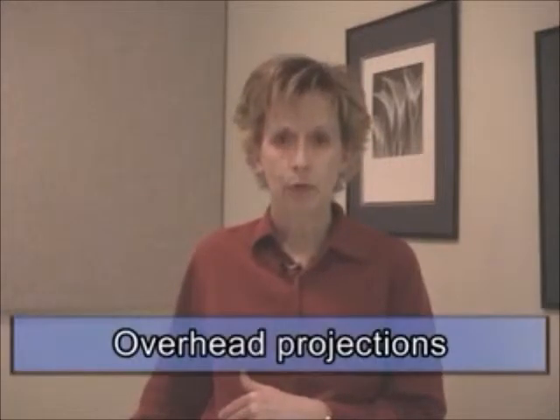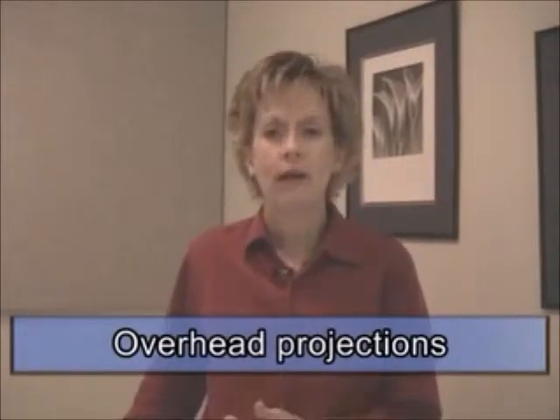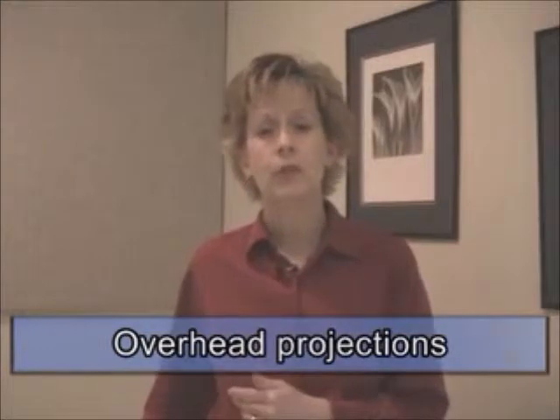The physician leaves, and then we as technologists will come in and take what we call overhead projections or films after the fluoro. And that's the purpose of the demonstration today. Not the fluoro setup or what you do during fluoroscopy, but it's going to focus on the overhead projections afterwards. And I will start with a logical order from the esophagus, stomach, we'll talk about small bowel, and then we'll talk about colon. Let's go to the table. We'll see you in a minute.